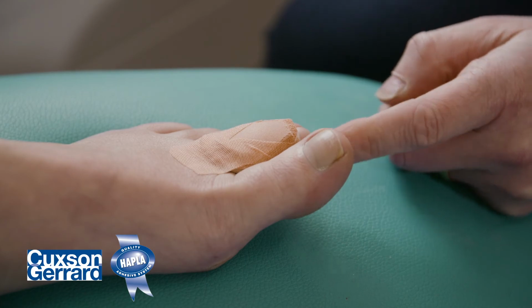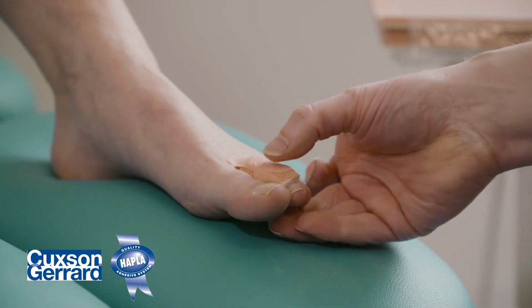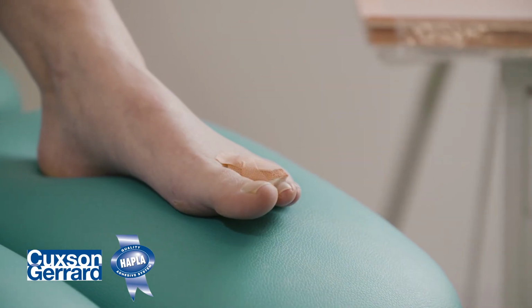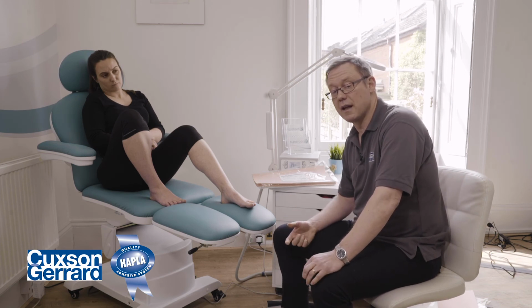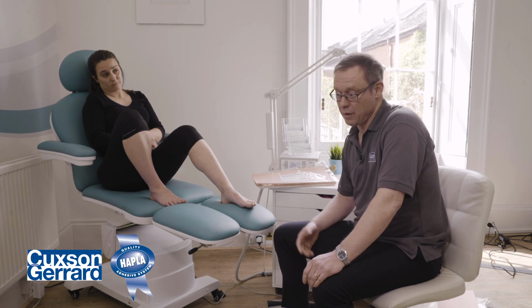And there we have then, I mean, a further retentive strap could be placed over the front if you wish. And that then is a cushioning and apertured pad to offload the pressure to an area either distal or proximal interphalangeal joint where there's been pressure changes or pressure reactions from the skin from primarily footwear.